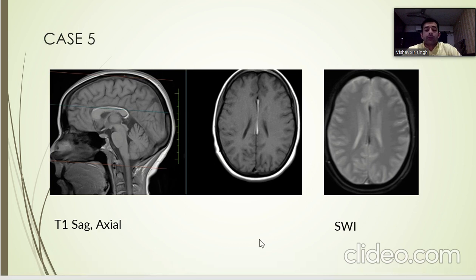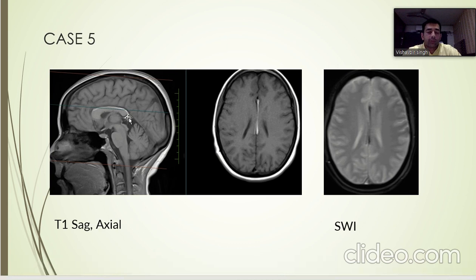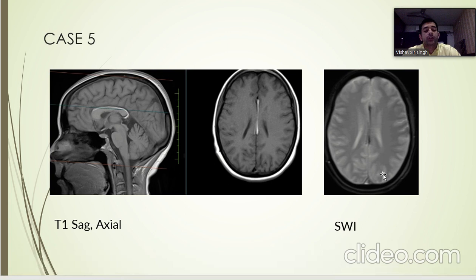In Case 5, we see another pericallosal linear hyperintensity which shows hyperintense signal on transverse section as well, and signal dropout on SWI images.